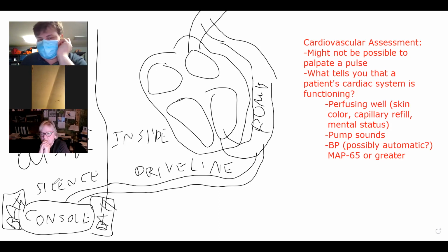If it suggests there could be an issue with the VAD, then you're going to want to consult with the VAD coordinator on which hospital is the appropriate destination, because they might encourage you to bypass the local community hospitals and proceed directly to a tertiary care center like Dartmouth or UVMMC.